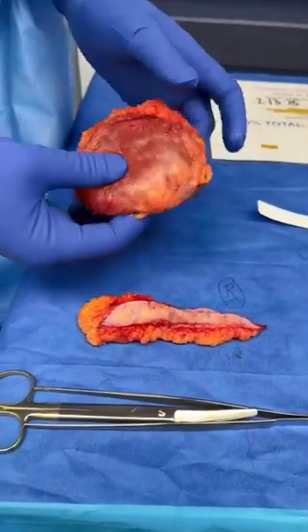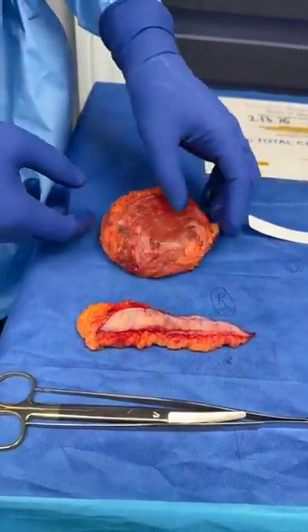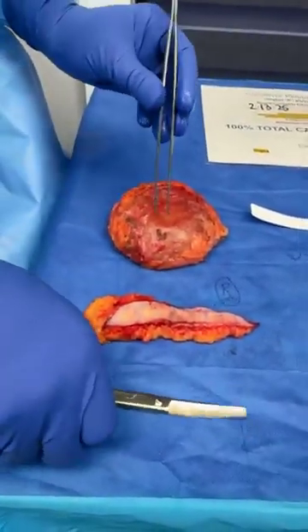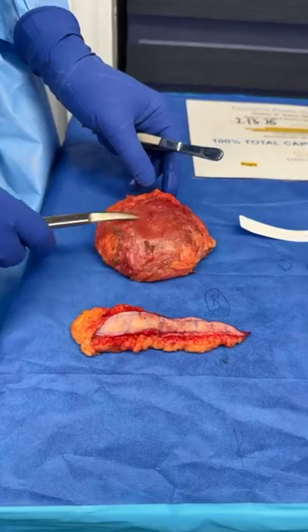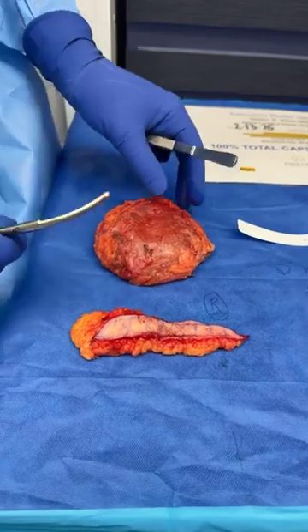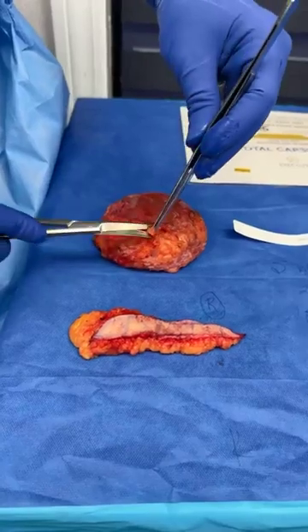Inflamed tissue, there was a lot of inflammation that was present, and I'm overall very happy how the whole dissection has gone. So in my practice, as you will see, it's not only the implant, but also the capsule tissue that's there, and also that inflamed tissue around that needs to go. So let's go ahead and cut over here to see what this tissue is about.